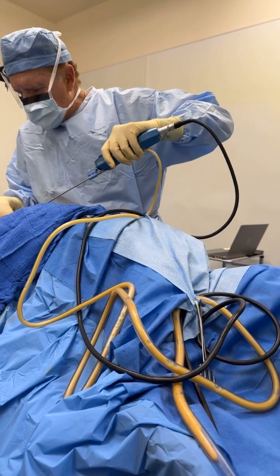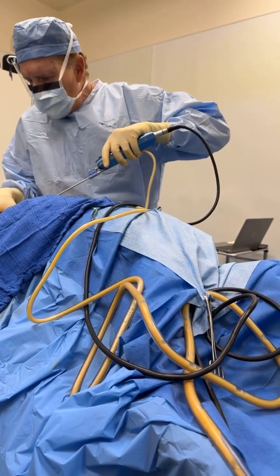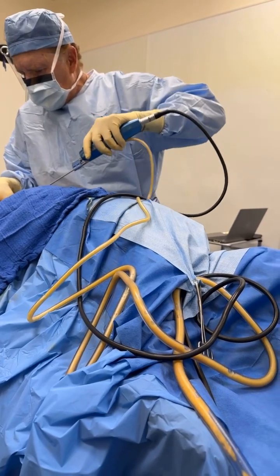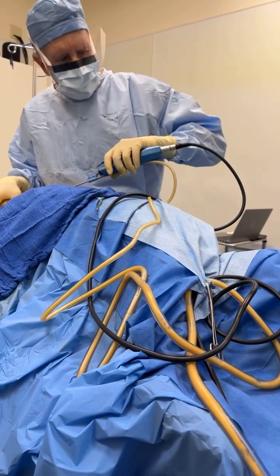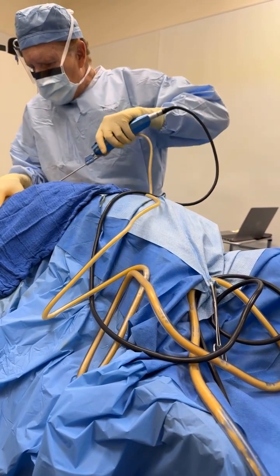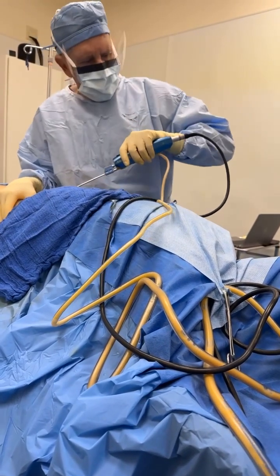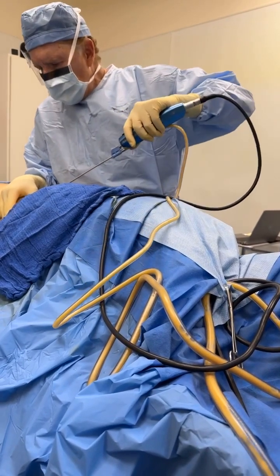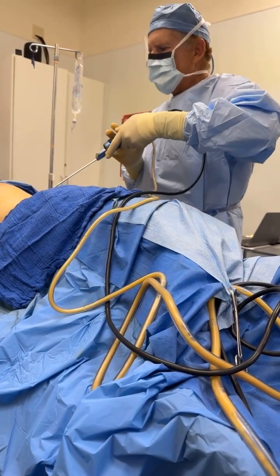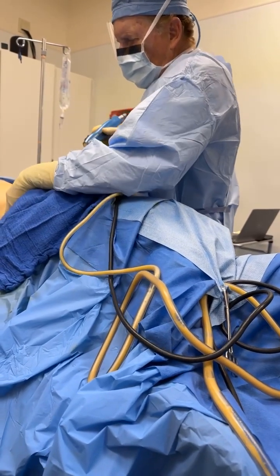The surgeon also has benefits because of the reduced risk of, let's say, epicondylitis or tendinitis, the result of repetitive motion. You can have tennis elbow, or you can have problems with your shoulders or your tendons from the repetitive, very fast motion that the surgeon has to do. And that aggressive motion, going so fast, can result in bleeding, oil cysts, and even when you do the fat transfer to the buttocks, you can also have a fracture.